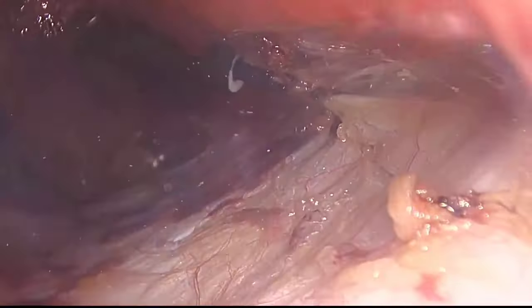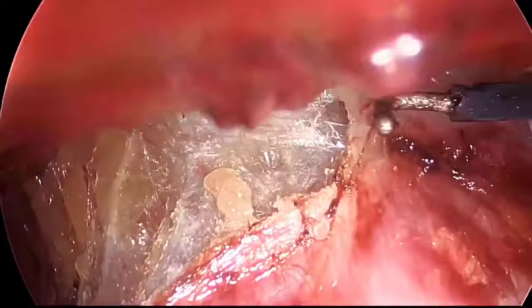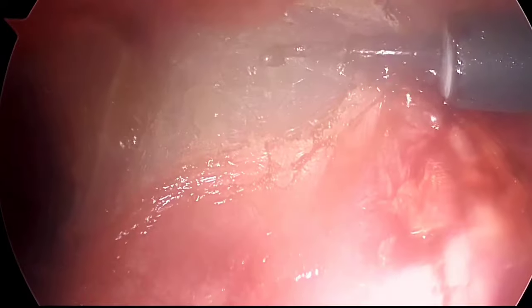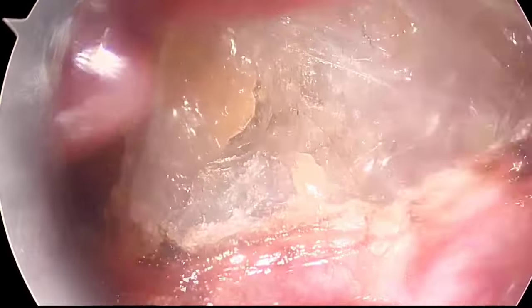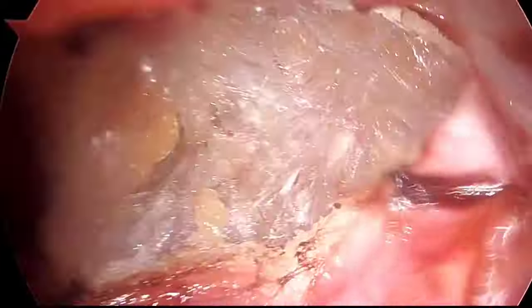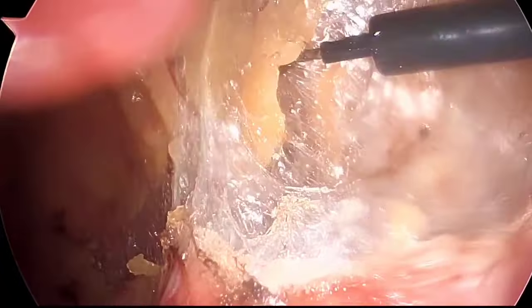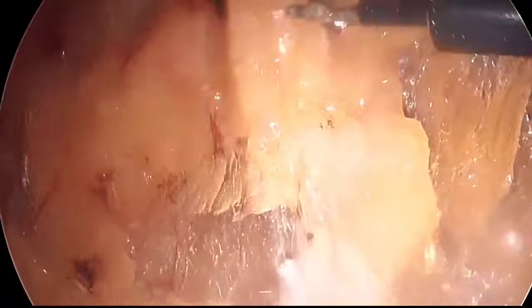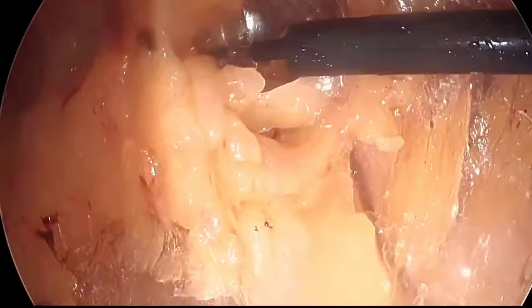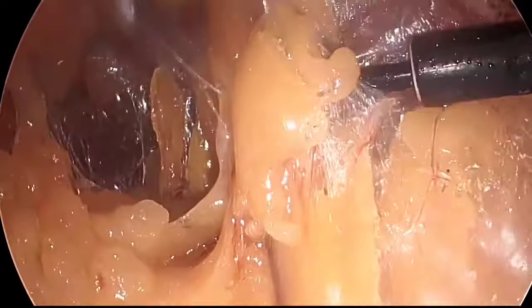Once a little bit of space has been created, I changed my camera from 10 millimeter 0 degree to 5 millimeter 30 degree and put the camera in the lower port, and using the hook from the upper port, the initial OptiView port, creating further space to do the lower midline crossover. So you can see just dividing the posterior rectus sheath just below the linea alba to gain access onto the preperitoneal space on the right side and onto the lower down.